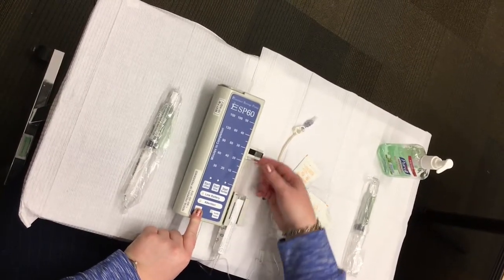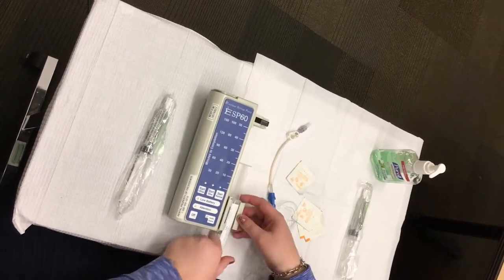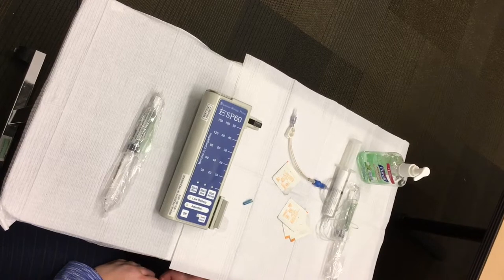Pinch the slider arm and slide it up. Remove the syringe from the pump and either discard the syringe and tubing, or apply a new sterile red cap if you have been so directed.